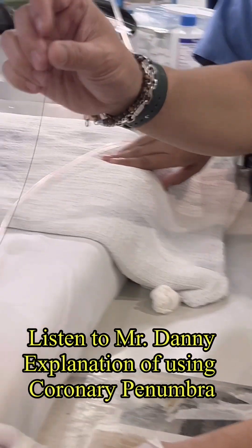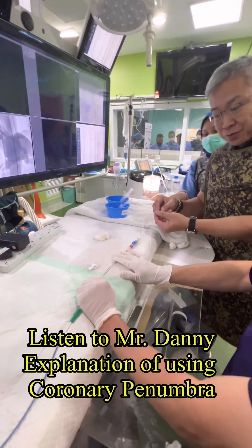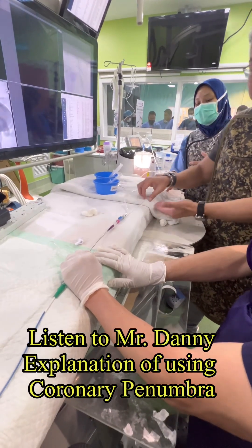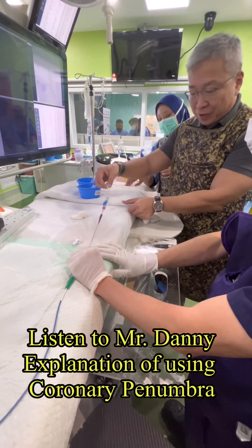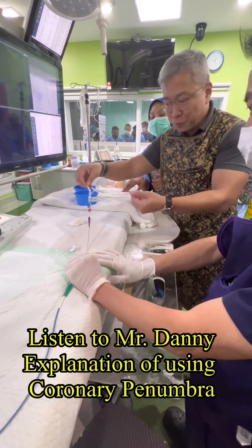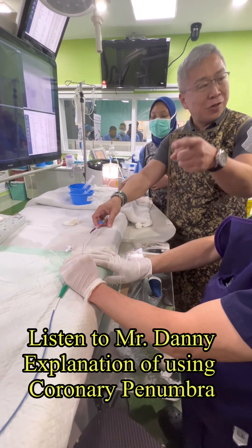This wire is actually your usual O14 guide wire. So for this, you know, the CATRX — same thing like how you load the stent and balloons. You look through this guide wire and then rapid exchange. So this is how it looks. This system is actually guided by your guide wire.